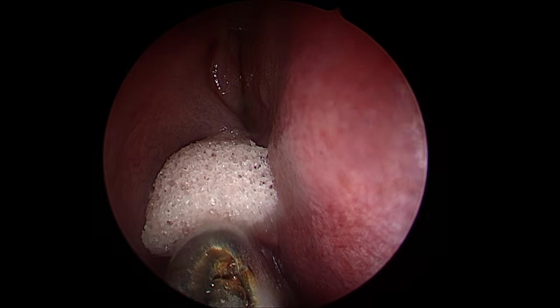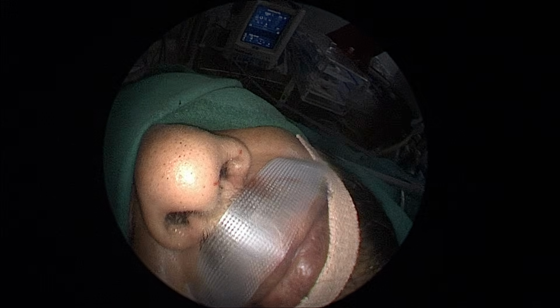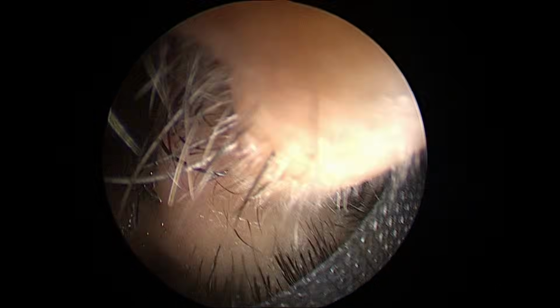Now on non-contrast, you can easily miss it, but if you are sharp and suspicious, you can notice the bony irregularity behind, abnormal bony osteitis, excess bone, bony erosion, ballooning of the disease coming out of the sinus, which is unusual and unilateral. This should be followed with an MRI. Otherwise, if you are not suspicious, you take the patient to the table for polyposis and you get an intraoperative surprise of a tumor behind.